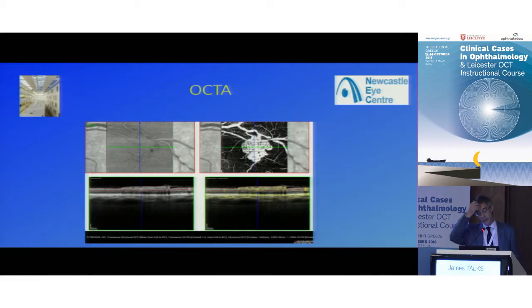And there is an argument, if you go back to the original branch retinal vein occlusion studies, the CVOS and the BVOS studies: do you laser a new vessel elsewhere prophylactically? And actually the outcome of that study was you don't. You wait till it bleeds or causes trouble before you laser them, because the risk of it doing you much harm is very small. I think they are quite old studies and their endpoints were blindness, so we probably tend to intervene earlier than that. So I think I would treat this patient because they definitely are quite ischemic. But it's interesting just to consider that the trial data does suggest you don't need to.